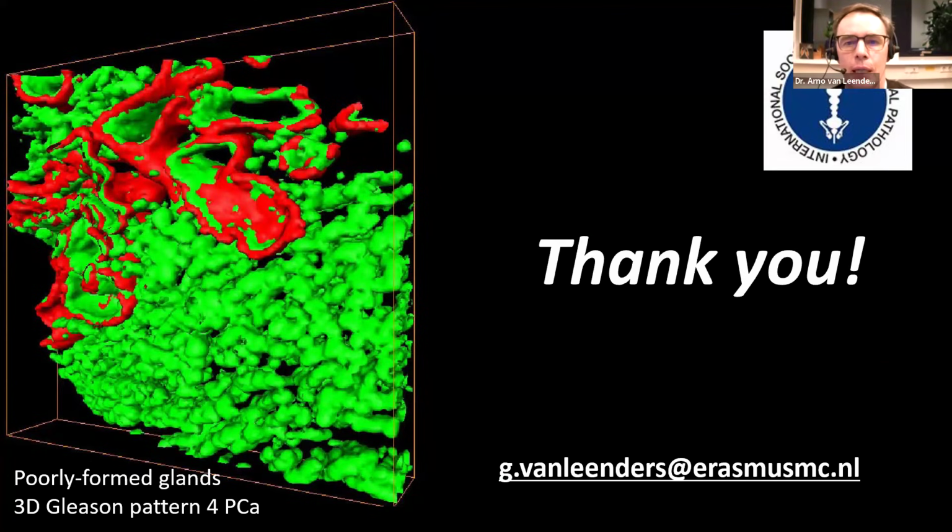So you will have distended pre-existing glands, but there are more lumina than epithelium. And I agree, this is quite subjective, but that's currently how the distinction is made. AIP is also what we used to call cribriform PIN. So then you would not have a distended gland, but there is a small cribriform area. So that's how we still define it.